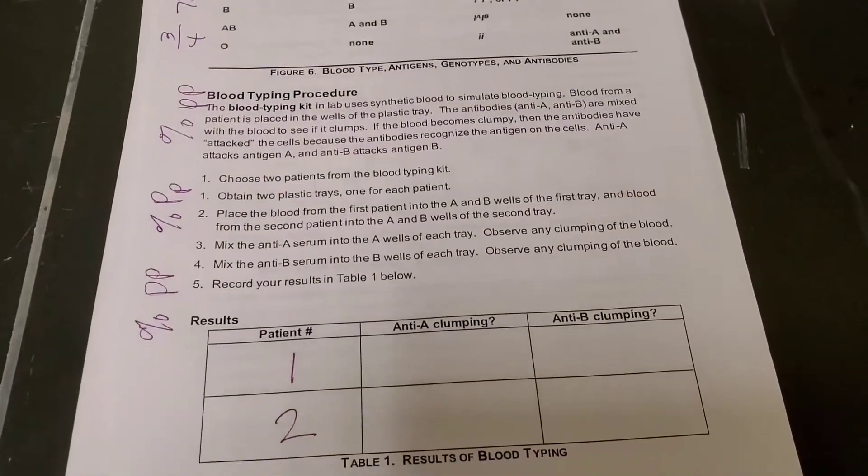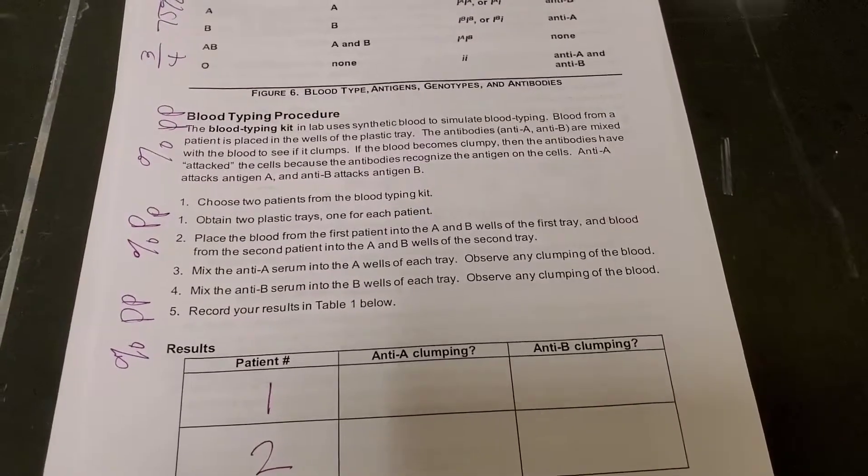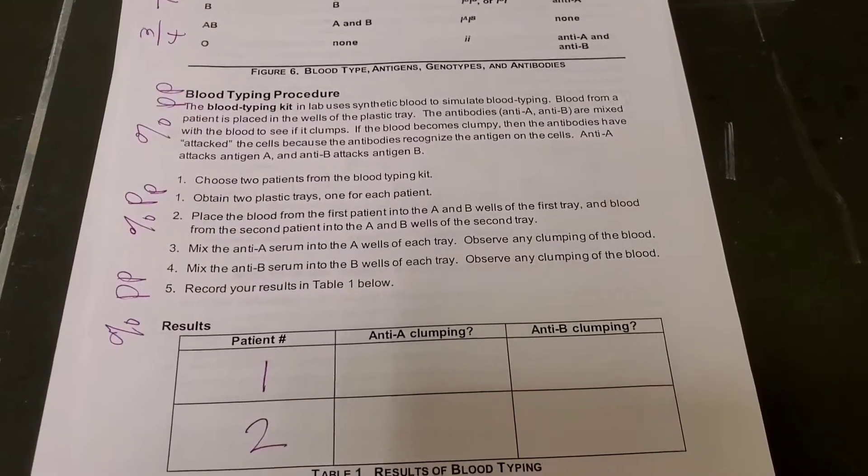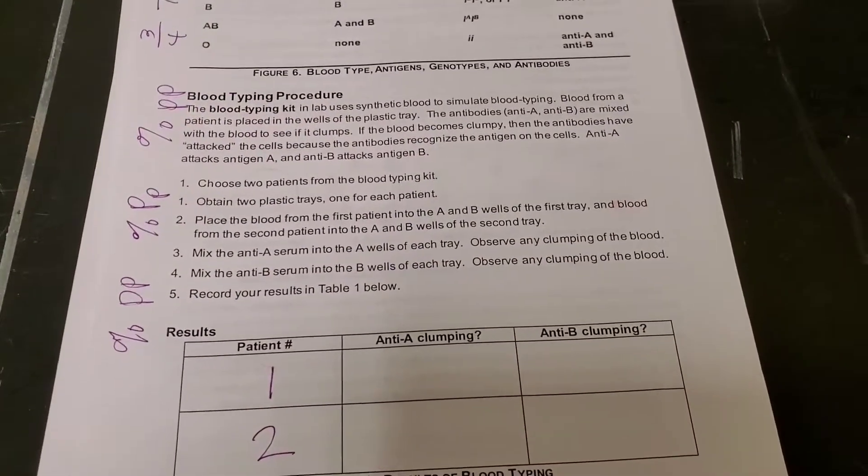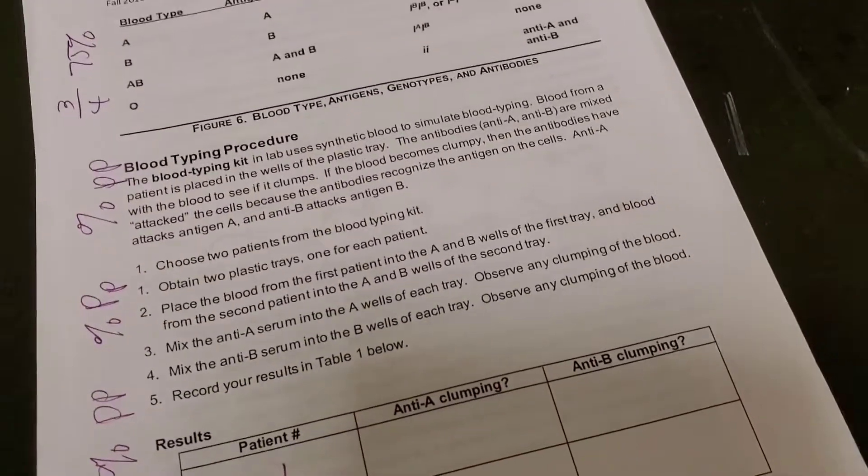Hello students, we're going to do this blood typing procedure for the lab, the chromosomal genetics lab, lab six. We're going to do the procedures right now together and then you can interpret the results for your lab report.